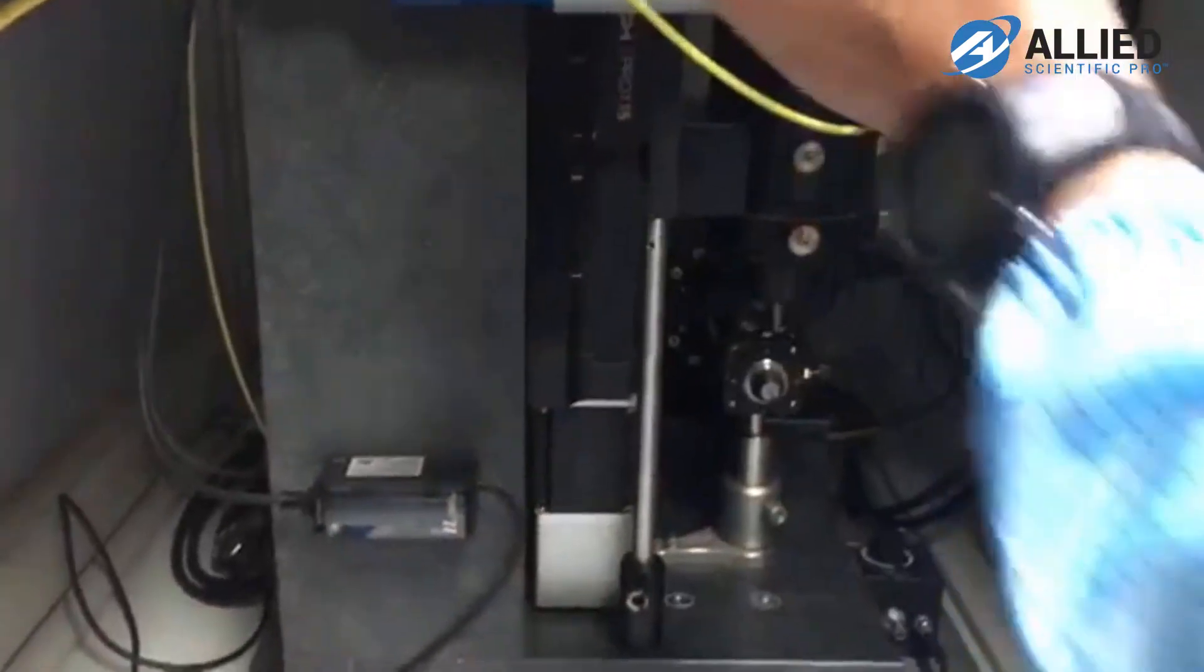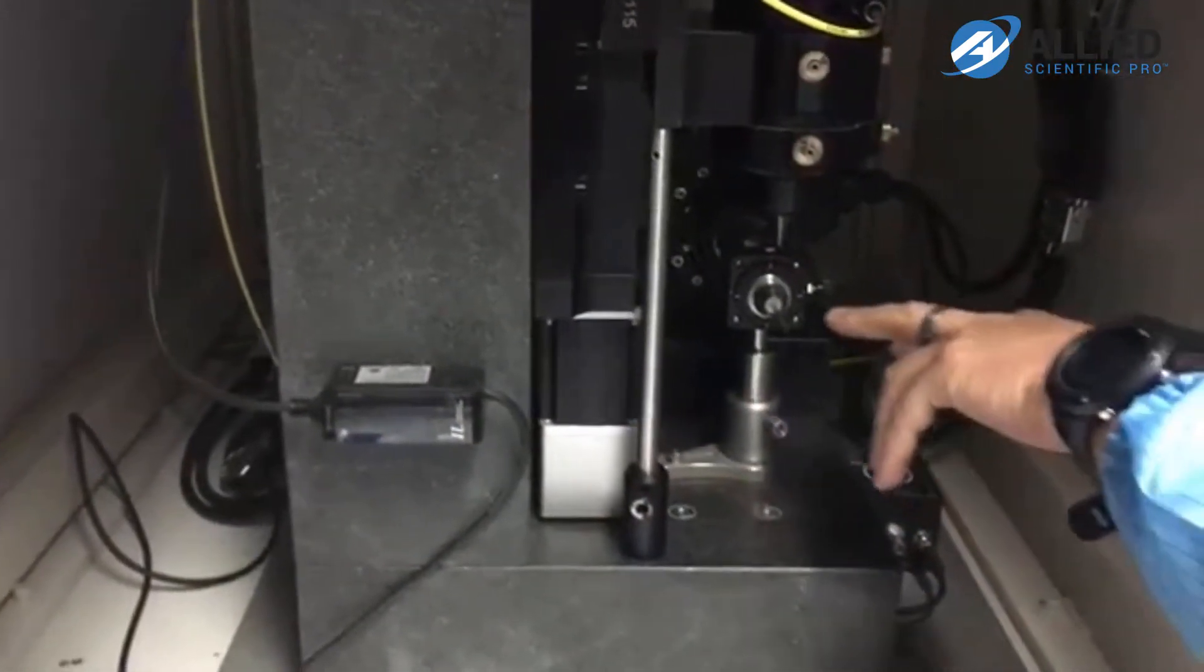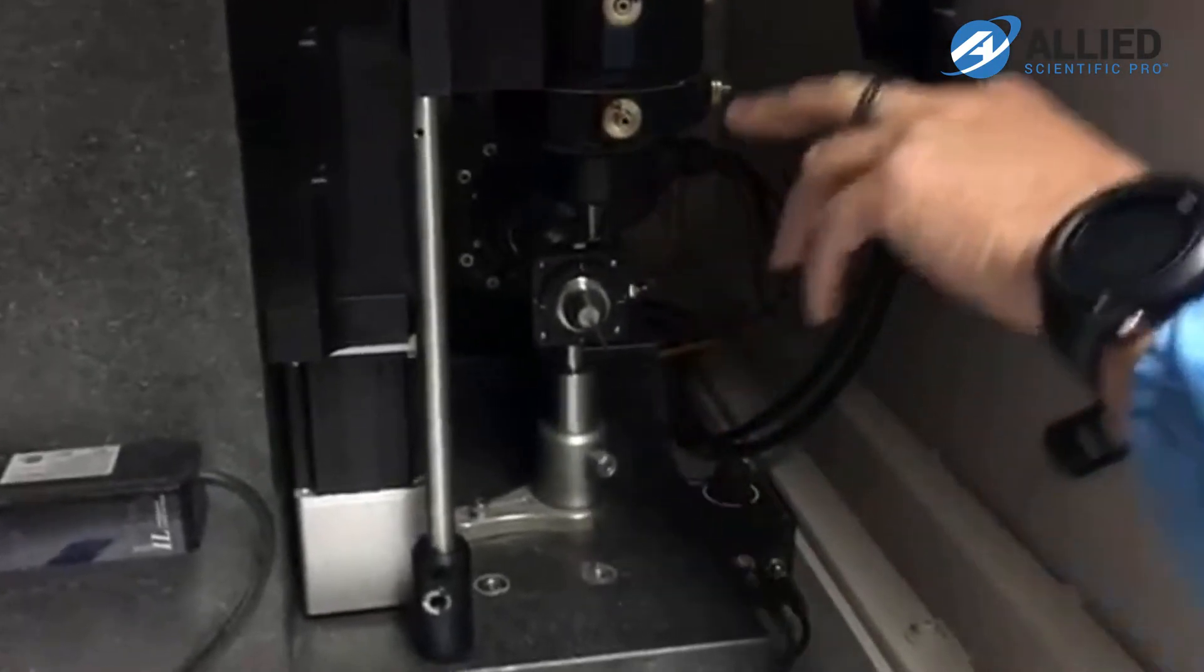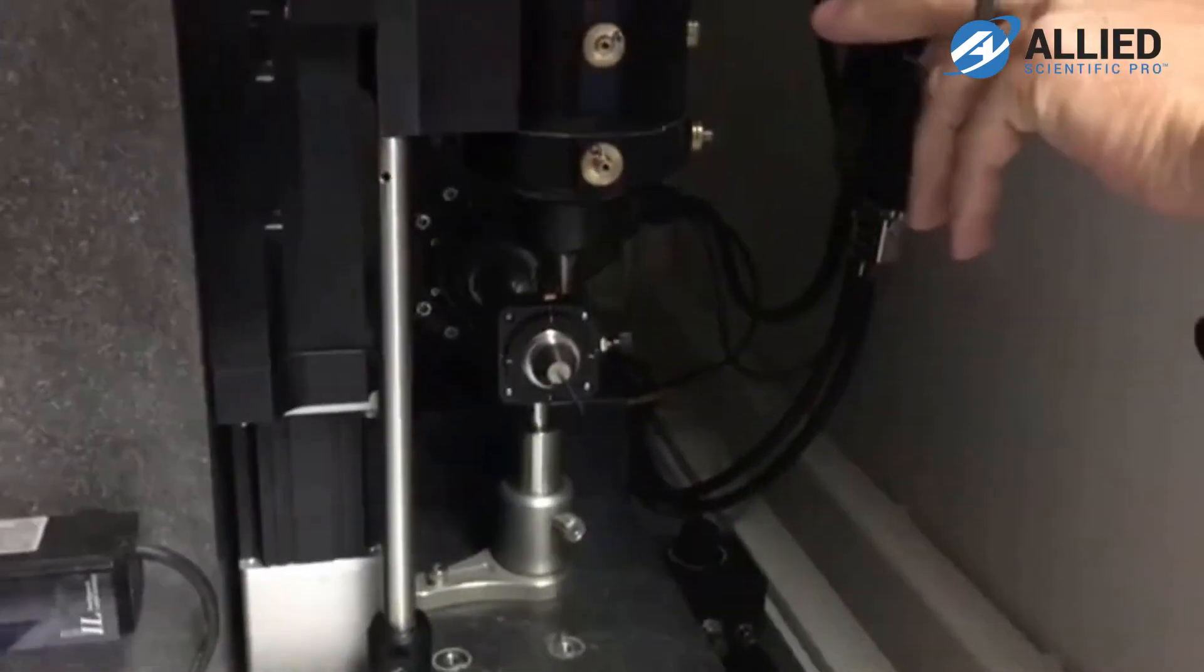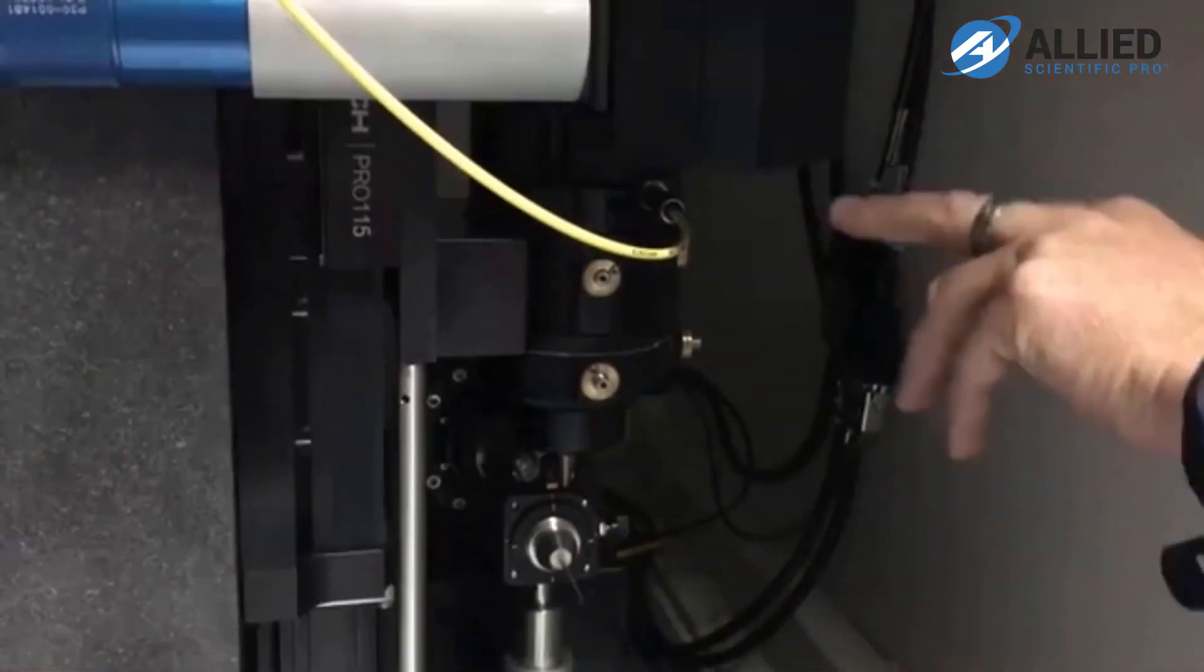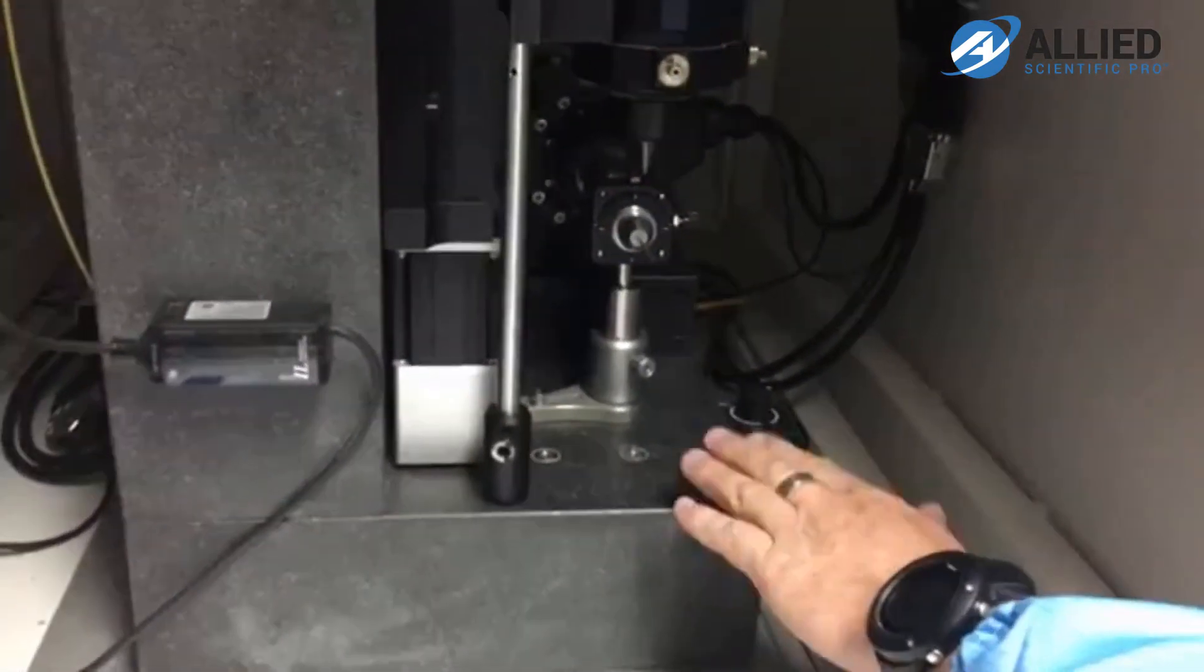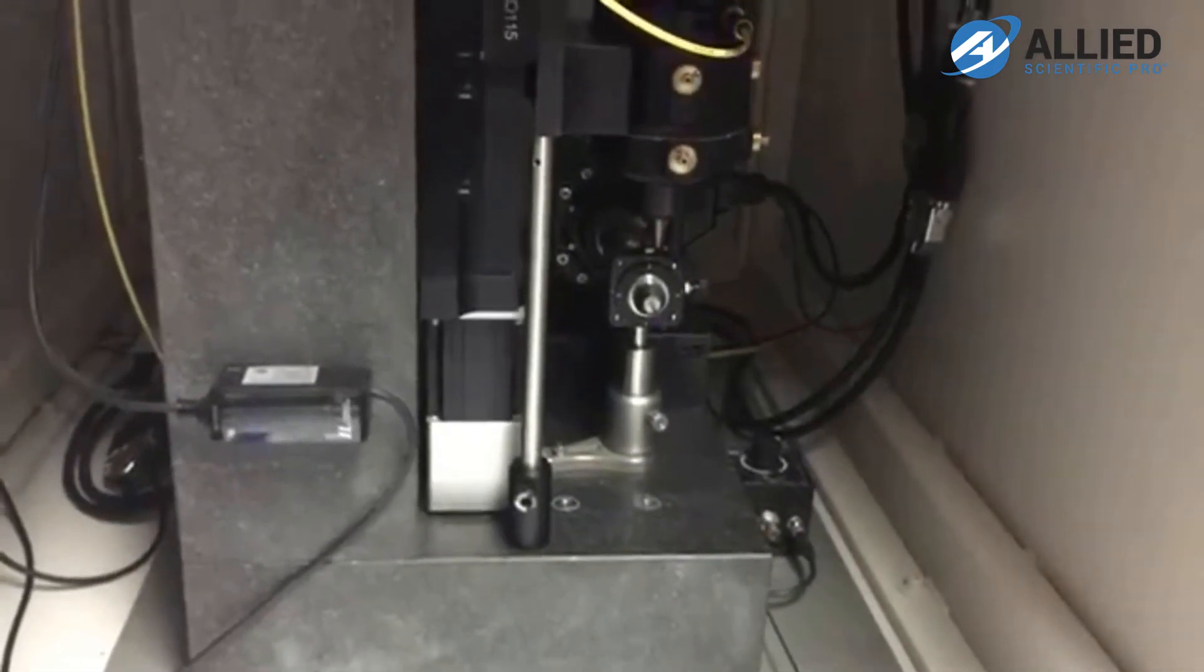This is part of the autofocus system. You can see the little tube of the stent here. The focusing optic train is also over here, and it's sitting on a marble, very stable table.